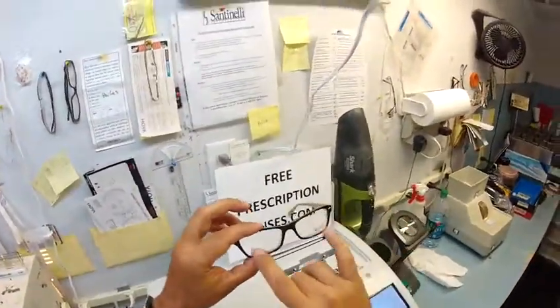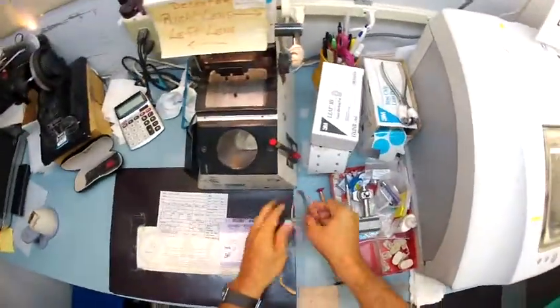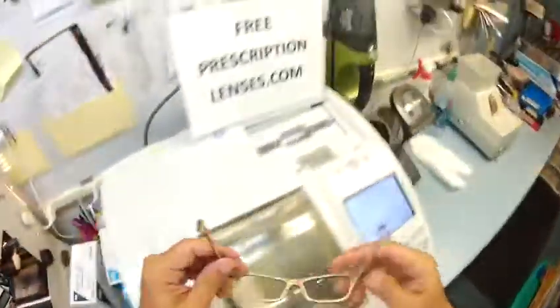So the first thing I'm going to do is take out your original demo lenses that come in this frame, the ones that say RayBan on them. I'm going to pop them out very quickly. In fact, put these in your case because you can receive those if you like.